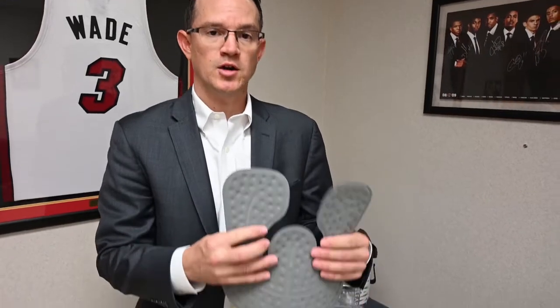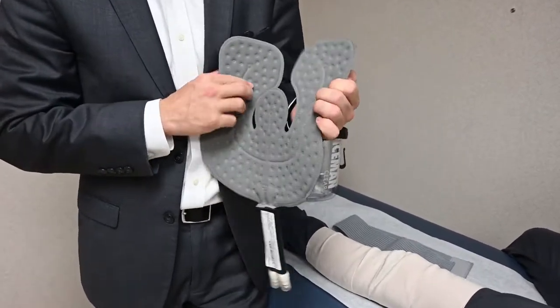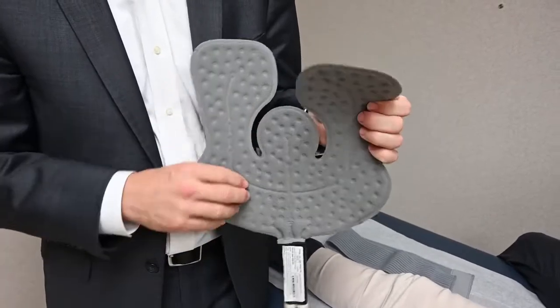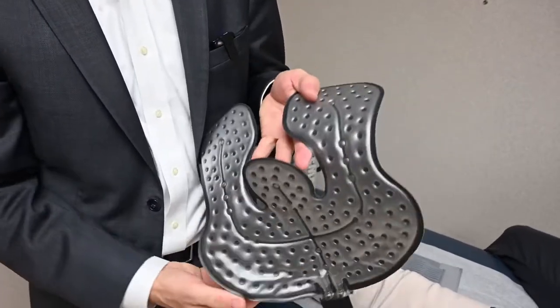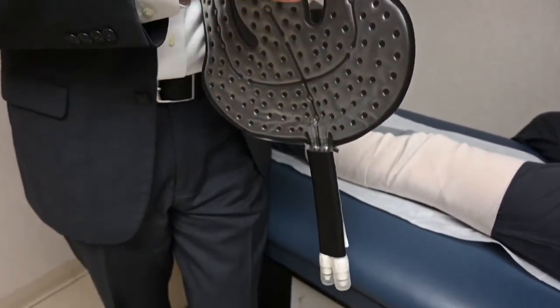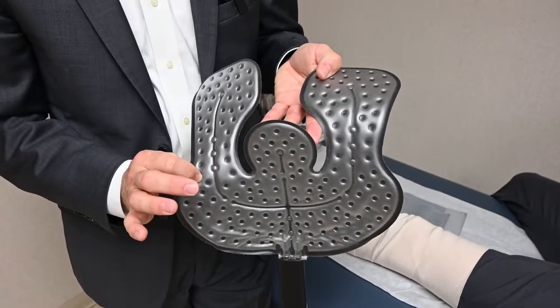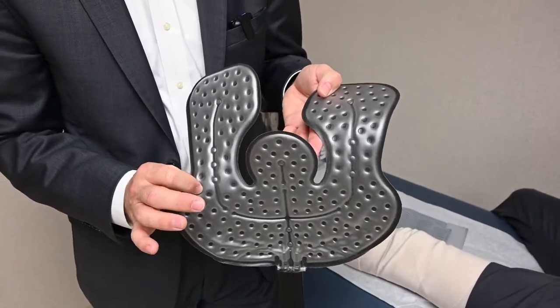This is the polar care pad. There are two sides to the polar care pad: the gray side and what I call the water side. The water side is where you'll see actual little water bubbles, and this is the side that you want to put down against your knee when you are icing the knee.